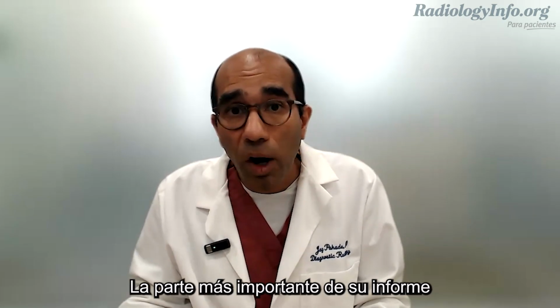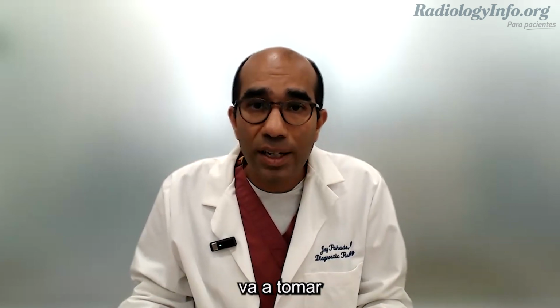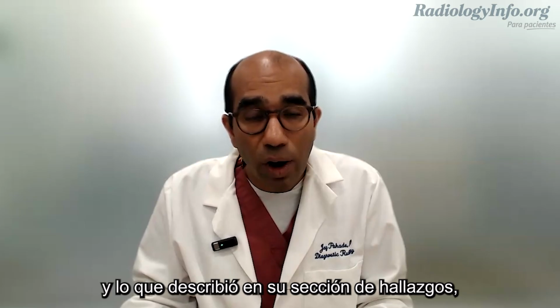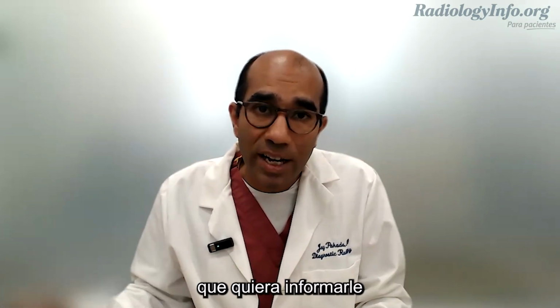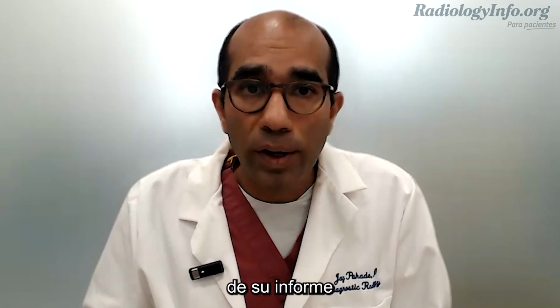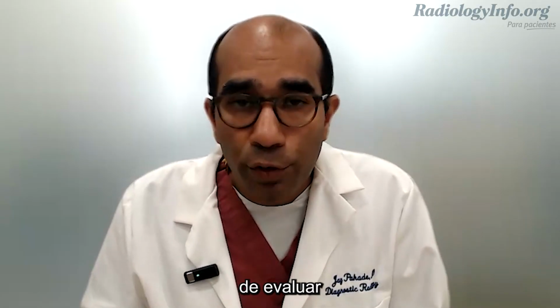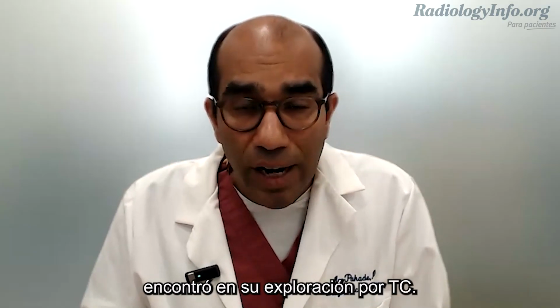The most important part of your report is the impression portion. This is where the radiologist is going to take what they saw in your scan and described in your findings section and put the most important things that they want to convey to your ordering provider. Therefore, the impression portion of your report is the part that you want to make sure you review with your doctor to go over what the radiologist saw on your CAT scan.